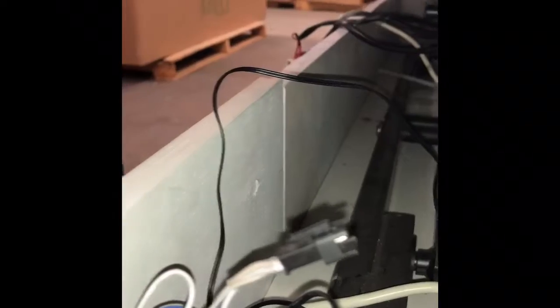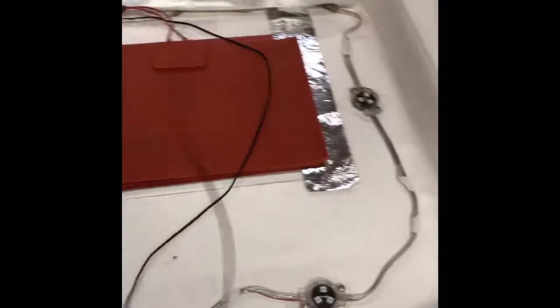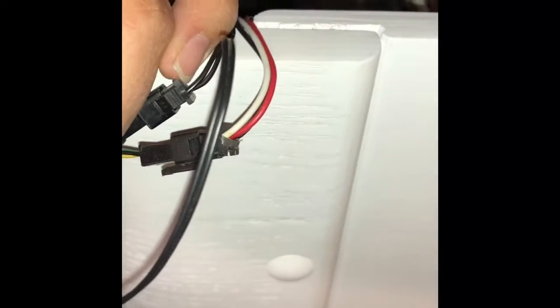What needs to be done is simply just go ahead and disconnect it, pull it out, and you're going to have this cable right here. This is the thermal fuse. This is the sensor, and that needs to be replaced as well. So the replacement, again, you're gonna do it the same way. For example, let's say this is the new replacement on that. We're gonna go ahead and connect it right back in here, right over here to this one, like this.